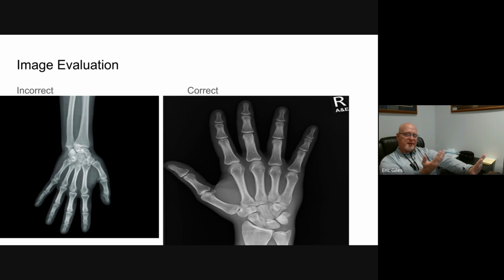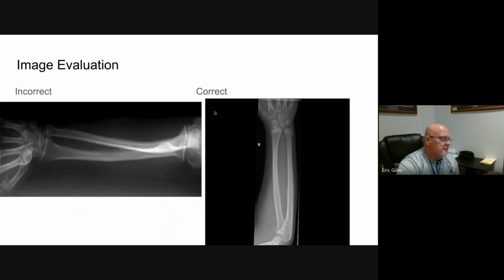Okay. So you're going to have to flip that image. So just pay attention when your image comes up post-process or after it's been processed and it's upside down or backwards. Just make the effort to flip that right side up, and make the effort to make sure that is annotated as a right or a left. Okay. Hope that makes sense, guys. Okay, let's go on to another one.